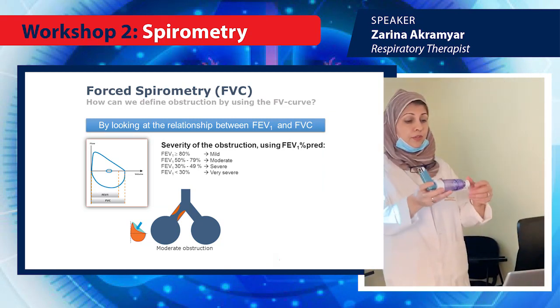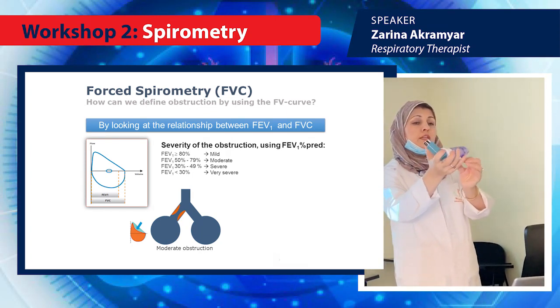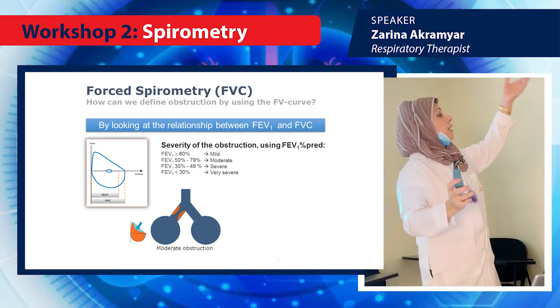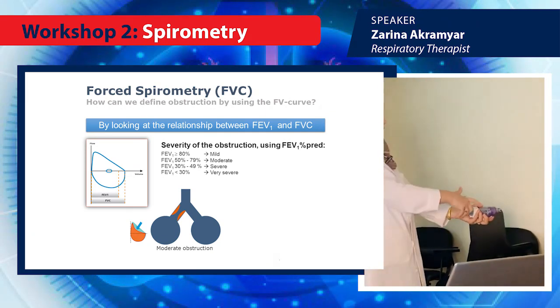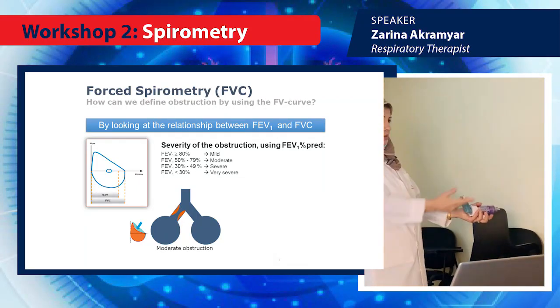So I prefer to do it myself. I put it here, I open this, I shake it well. I ask the patient to take a deep breath, blow out completely. Then I put it in his mouth, and I say push and take a deep breath, and hold, hold, and out.